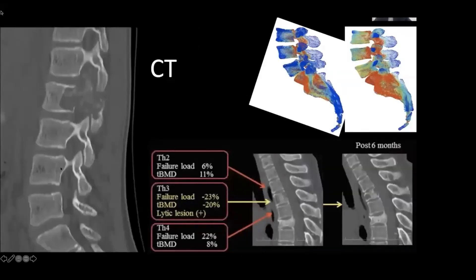CT is again depicting cortical bone very well. You have some assessment, as you can see here, of the trabecular architecture of the bone. For example, here you can see there's this infiltrative lesion. Just for orientation — you have your vertebral bodies, your pedicles, your posterior elements including your lamina and the pars articularis going down here, depending on the orientation of the CT.